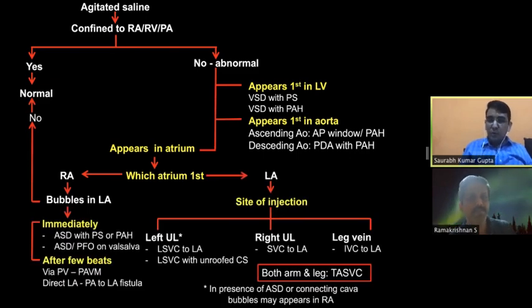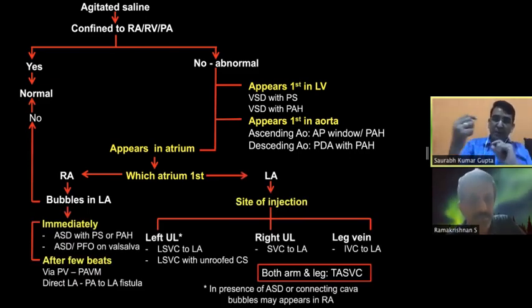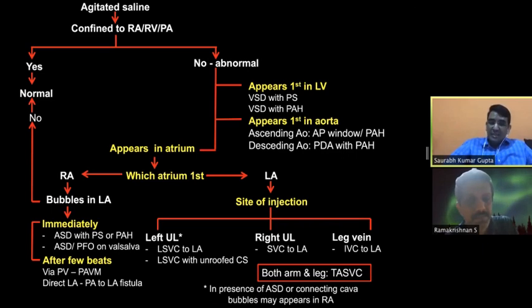I think if you think logically, if you are remembering the anatomic connections, then it becomes pretty easy. If you are using upper limbs, then you are talking about upper limb veins. Now, since the most common anomaly is left SVC, you tend to start with the left upper limb. And that arm is usually okay because most echocardiographers are right-handers, so it is easy to perform saline contrast for the other person also. So we start with left arm injection.